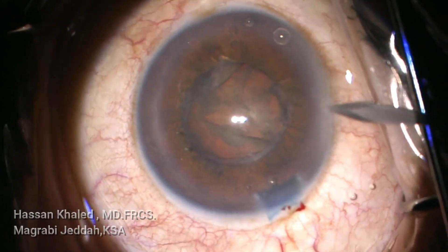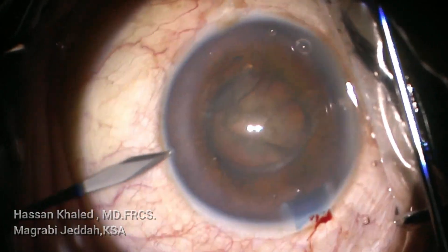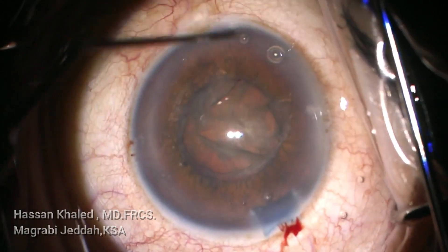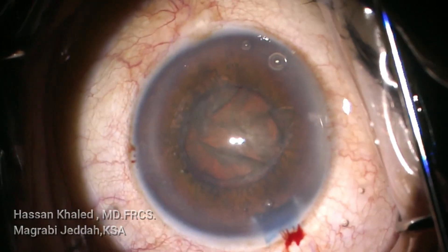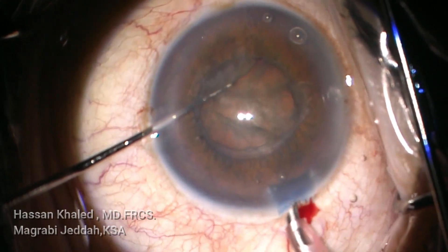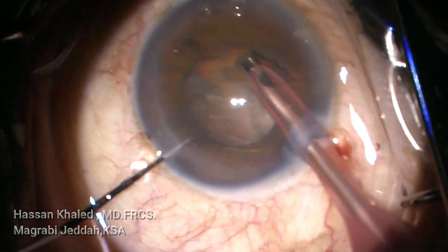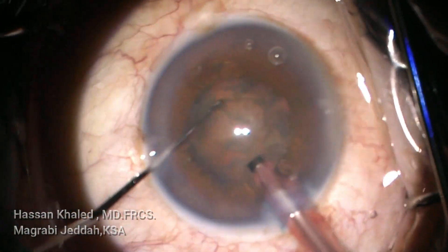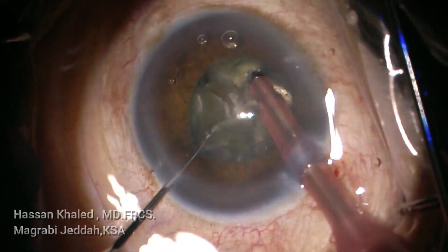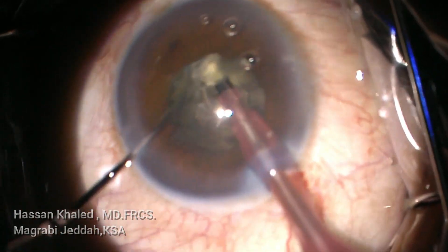You can see this cataract is dense. I will use the vertical chop technique to emulsify this dense cataract, using a sharp pointed chopper. First, shaving the cortex and epinucleus, then impale the phaco tip, then the chopper is vertical and you bisect the nucleus into two halves.